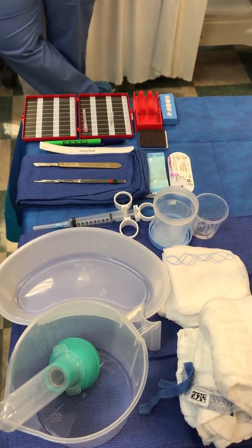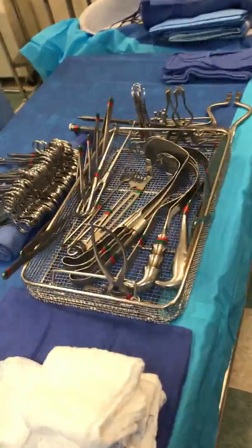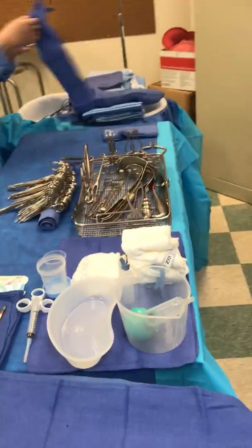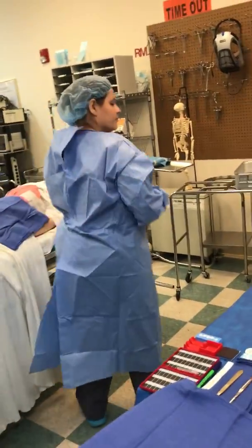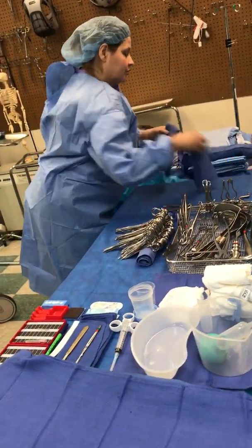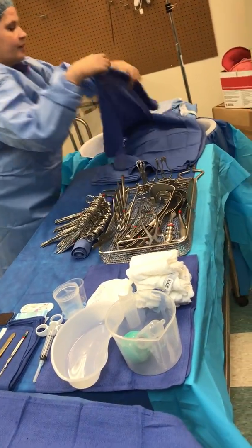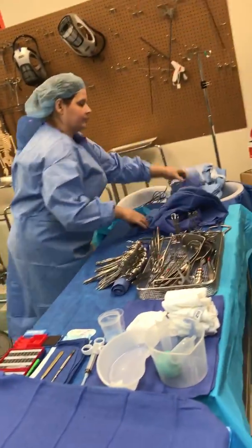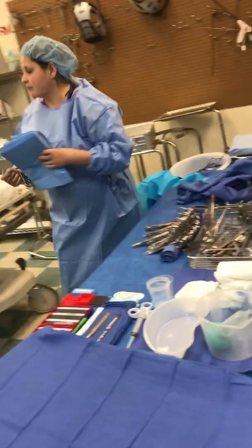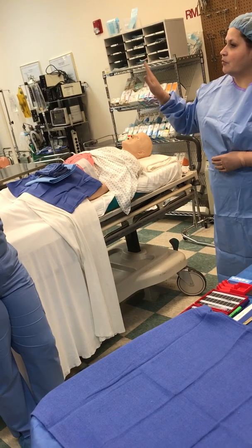You could put this on top like that, or you could put it this way. It doesn't matter. I do it this way. I actually don't do this. The way I do this with my surgeon is this. Regular. Nope. I go like this. I take 1, 2. I take my towels. I put 4 towels there with a 3/4 sheet. And this. Ellos mismos hacen eso.